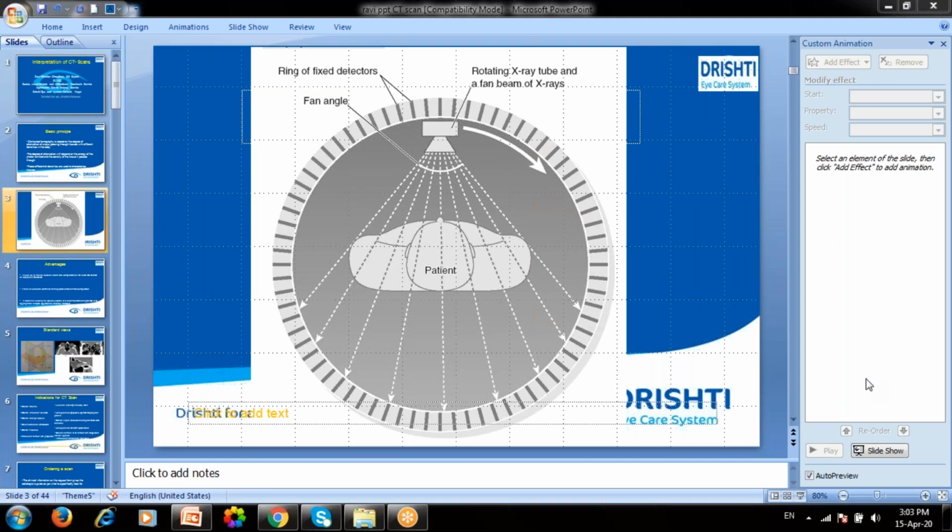No, because CT scan is an expensive one. So only in the cases where you want the surgery to be done, where you think the tumor has spread and you want to know the extension of the tumor, the CT scan has to be done, and it always has to be done before surgery. And if you think the mass is malignant, then after 1 month or 2 months or 3 months post surgery, you can do it to know whether the total mass has been removed or not.